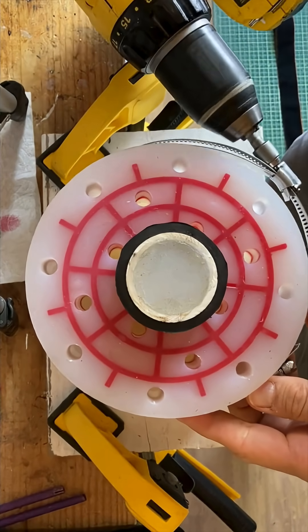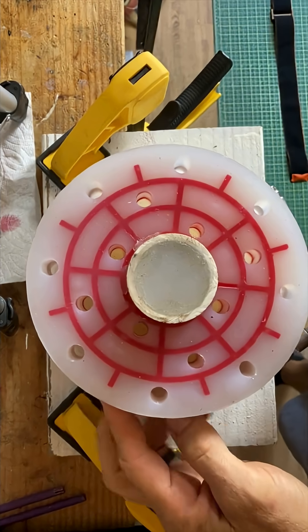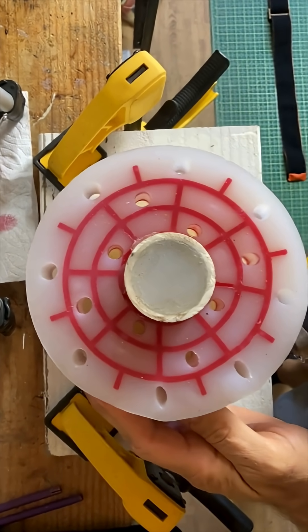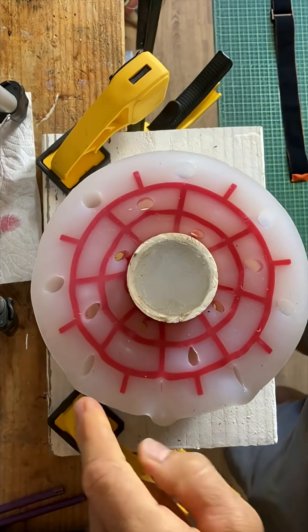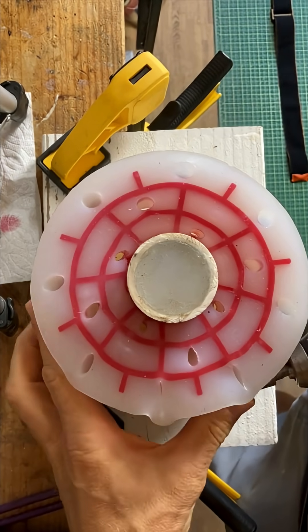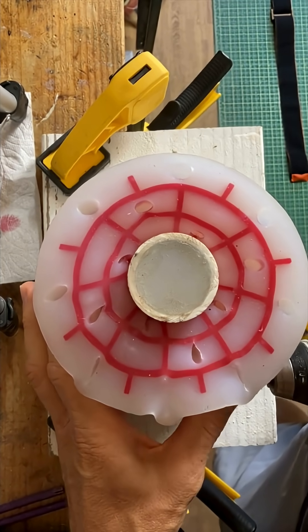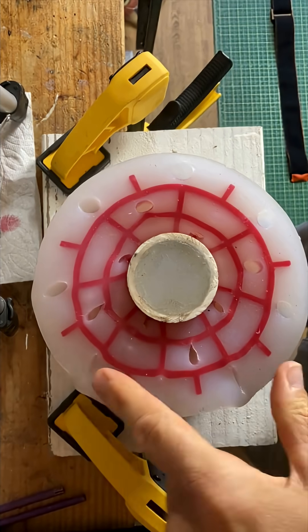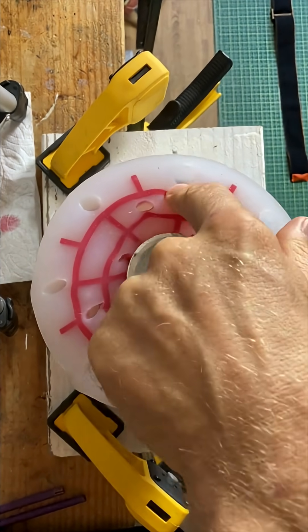I think what we'll see is the outer holes constrict first, and you'll also see that there's asymmetric squeeze. All right, this side is closed off. These are still open. The center ones are more open. This is going to be hard to show, but this is completely constricted. The middle I can still see through. The sides are all closed.